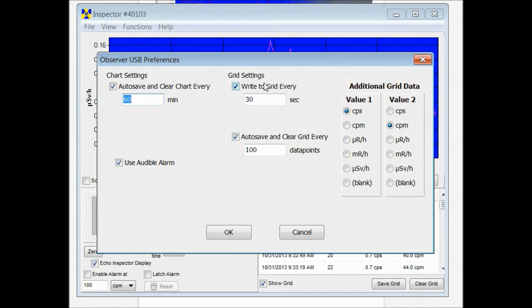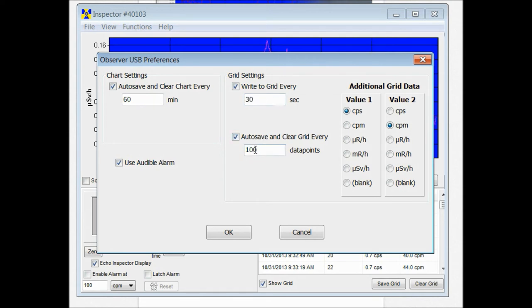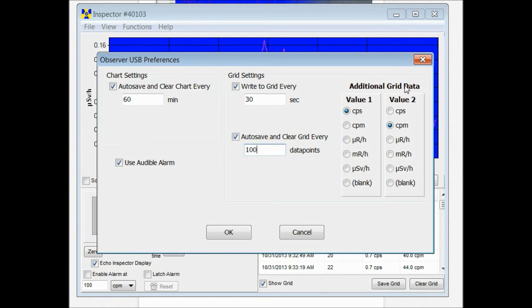Over here in the grid settings, right now we have it write into the grid every half a minute. And then you can also have it auto-save every 100 data points, every 200 data points, whatever you prefer. We also have the additional grid data over here. You can pick two units of measurement to be written into the grid. It's your choice.